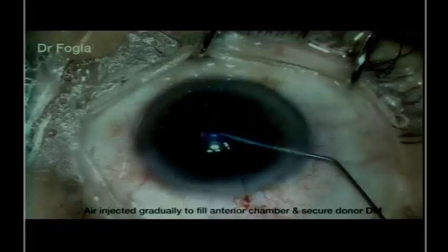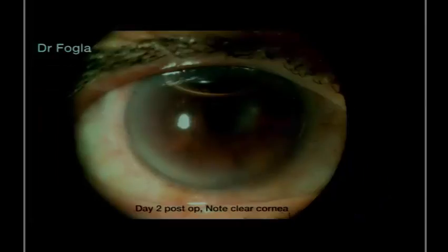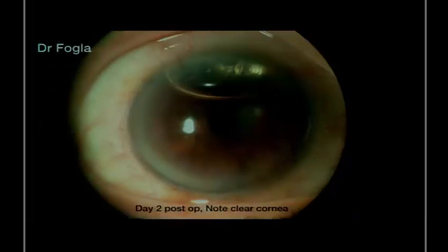Sometimes the DM may get stuck in some part of the iris, and even if it's not exactly in the center, I think it's safe to go ahead and put in your air bubble, because at times, to be very meticulous, you try to move it to the center, and then you realize that maybe the edge has got folded, or sometimes it flips over, and it can make life very difficult.